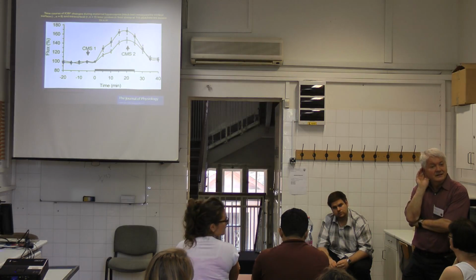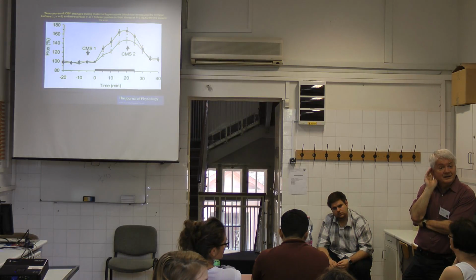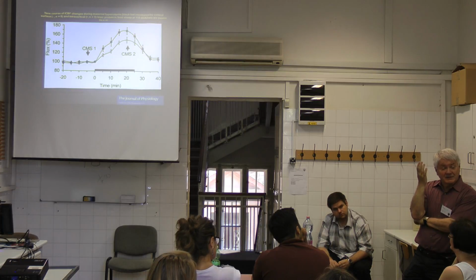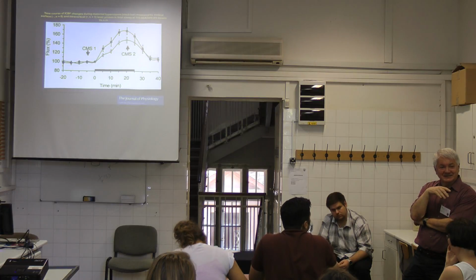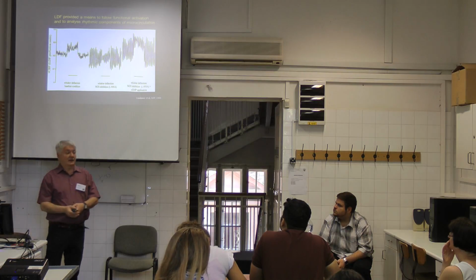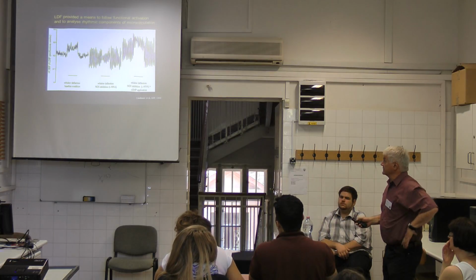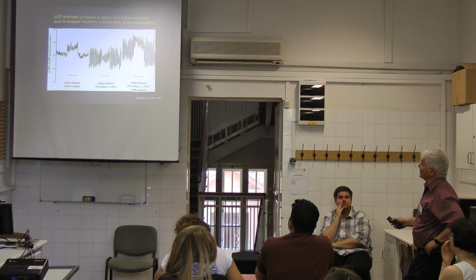What if we use nitrogen, because sometimes it's a vasodilator as well? What if we replace that with nitrogen instead of carbon dioxide? No, in the air we have 79% nitrogen. It is not sensitive to this. And also, as I have already mentioned, laser Doppler flowmetry is a very good means to study rhythmic components of the microcirculation.